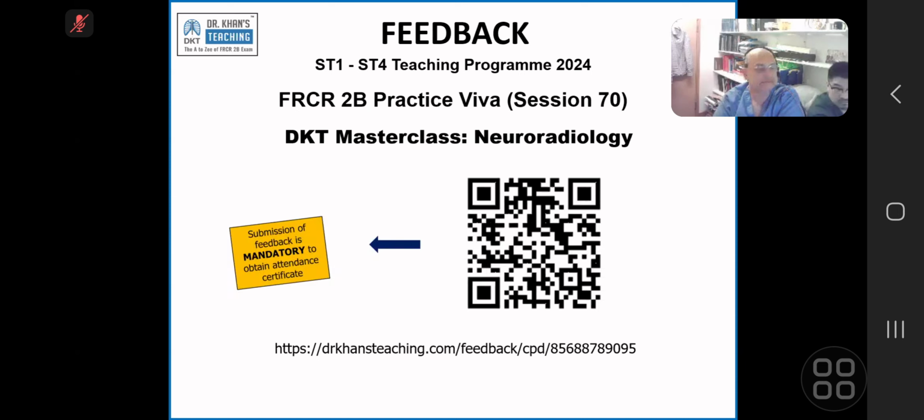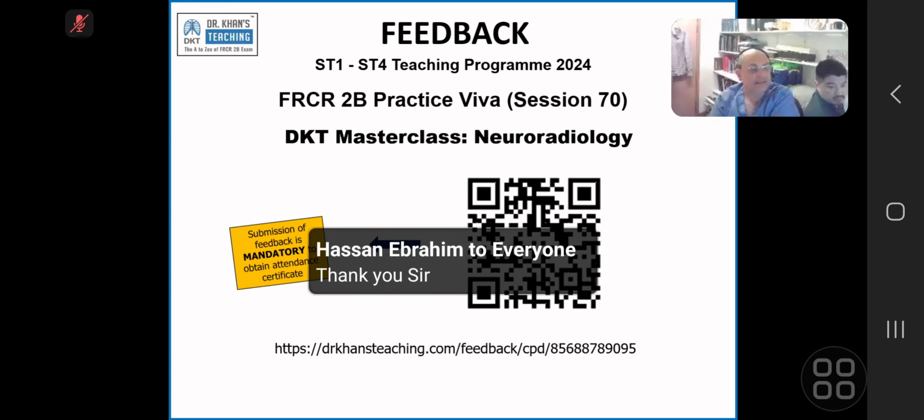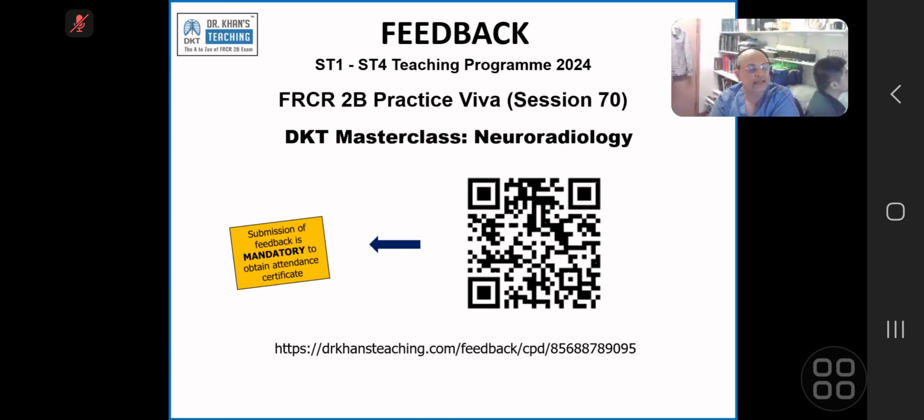What else? In the first case, we consider subependymoma. Yes, subependymoma usually can be in the differential. Remember, subependymomas have reduced enhancement. In that ependymoma case, the enhancement was more. But yes, subependymoma stays in the differential. That is correct.